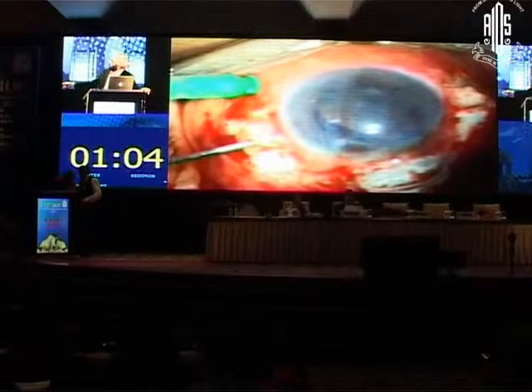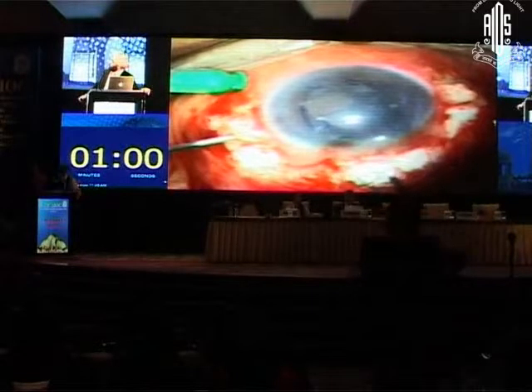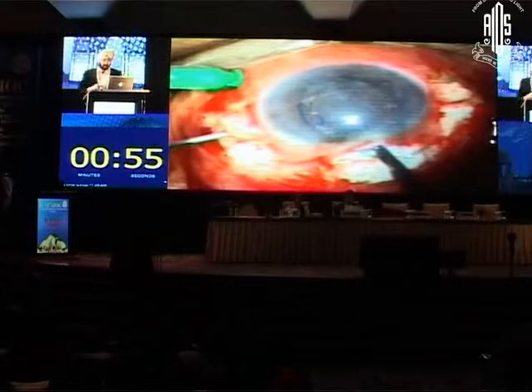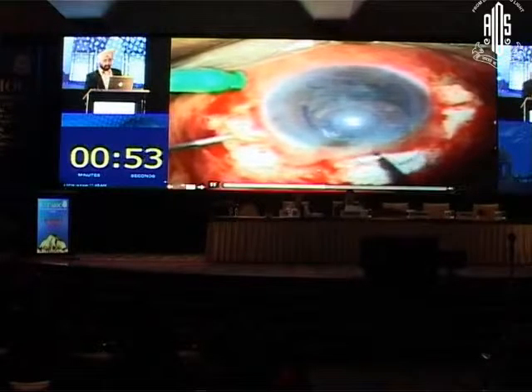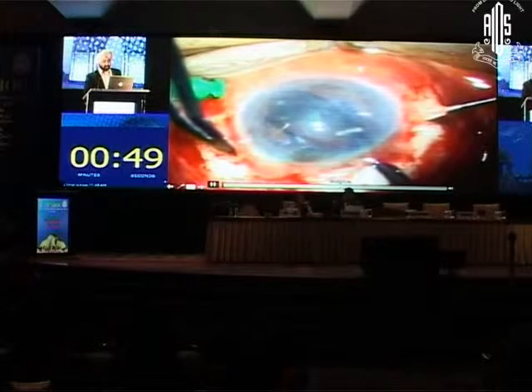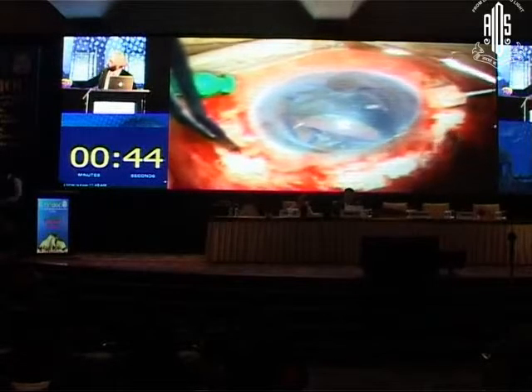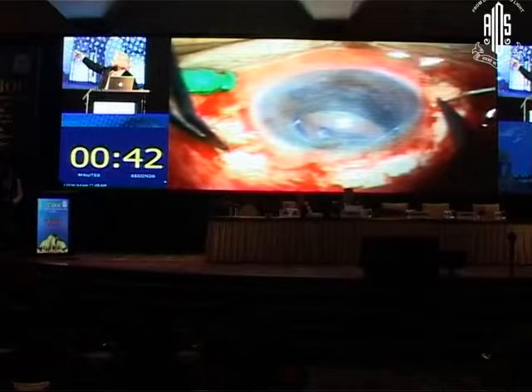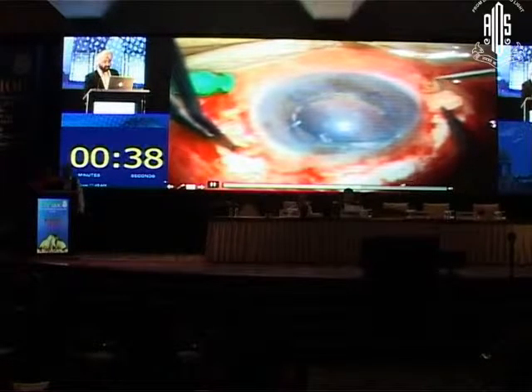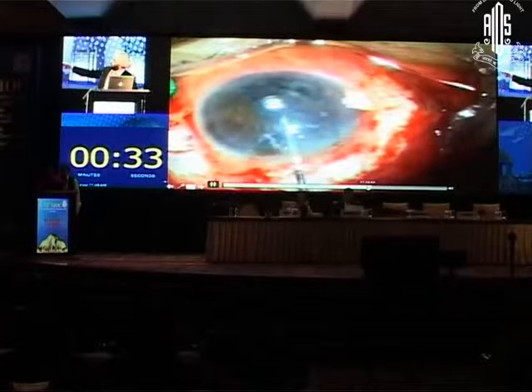This is a lens that we are using, a 3-piece lens, which is a typical lens that we have to use for gluing an intraocular lens. We push it into the eye, and then we go ahead and do the glued IOL technique. You can see that the haptic has been exteriorized from one side. That's the haptic that's being held by the assistant on the left side, and then you have the second haptic that has been withdrawn.